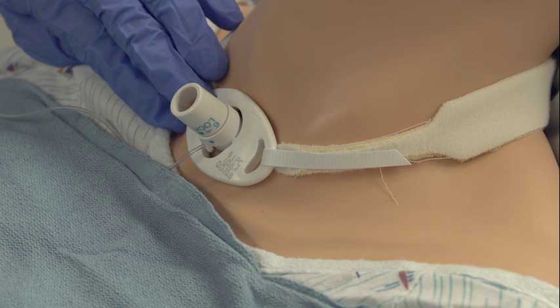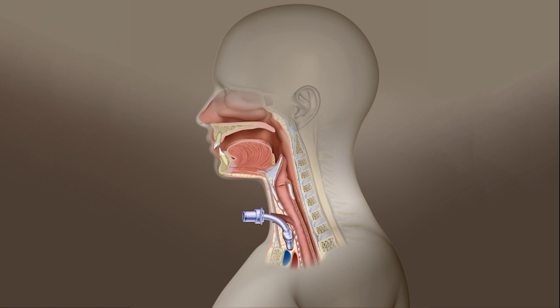When you are concerned about a decannulation, you must first inspect the tracheotomy tube in the stoma. The flange should be sitting right up against the skin. If the tracheotomy tube flange is away from the skin, and you can visualize the cuff or the end of the tracheotomy tube, then the tube is most likely not in the trachea anymore. If you suspect that the tracheotomy tube is no longer in the trachea, you should call for help.